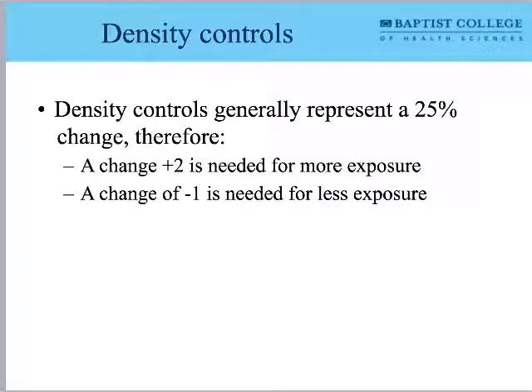Now, he talks about this on this image here. You can see what we're talking about. We've got a targeting system, and they've placed the target. It doesn't look like the target was quite placed over the area of interest. So this indicates where the ionization chamber was located on this exposure of a frog leg lateral hip. I don't think we've quite covered frog leg lateral hips, but just know we should be centered on the joint.